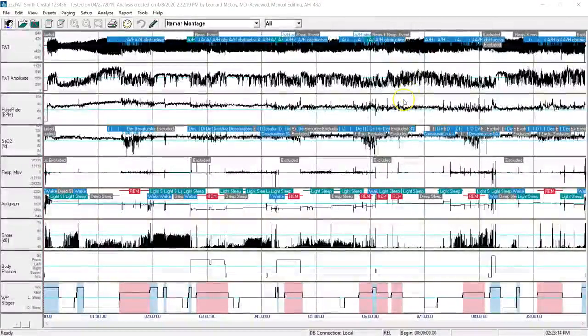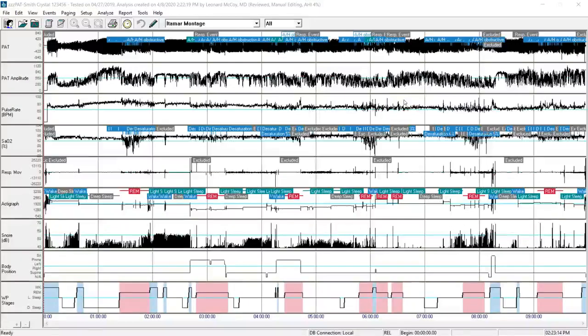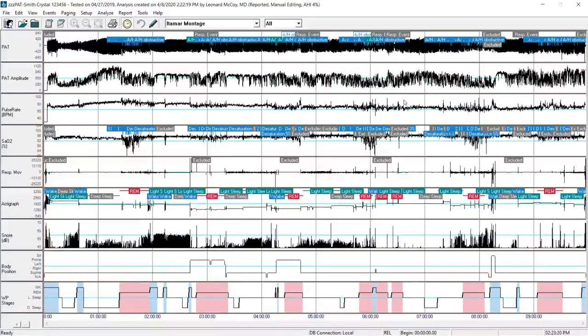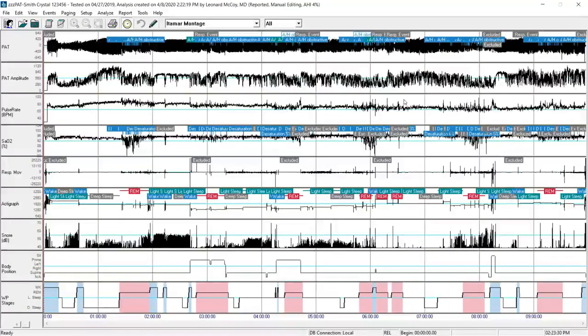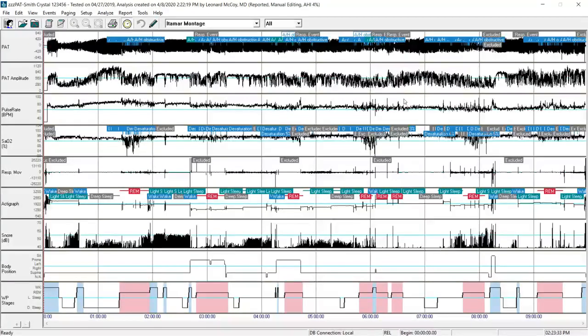The report is now locked and will no longer be editable. I can inform the tech or administrative staff to let them know I've completed the interpretation for Crystal Smith, and that they can print out the record as a PDF and import it into the medical record system.